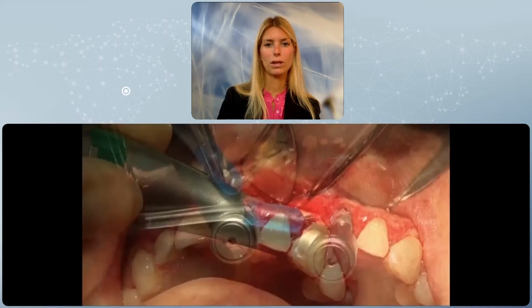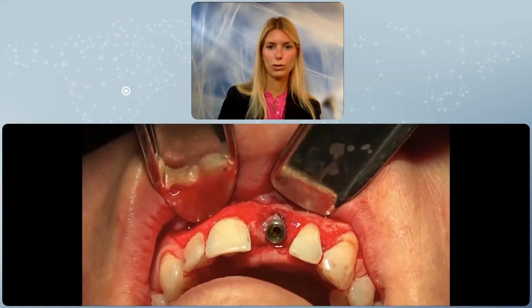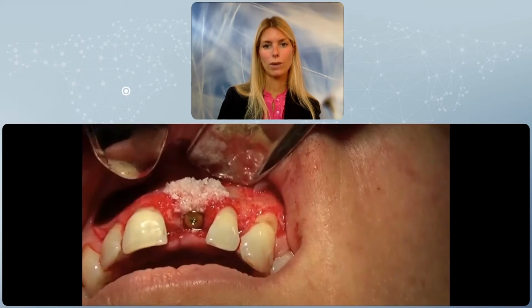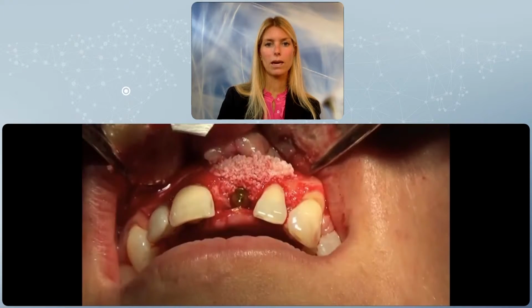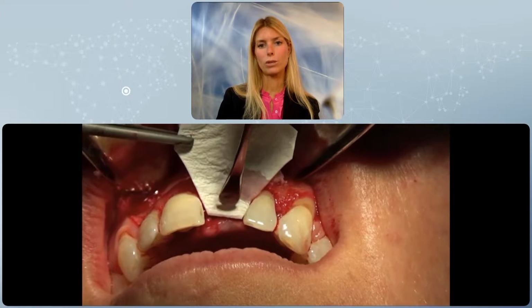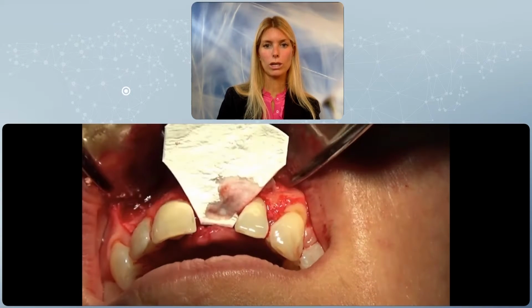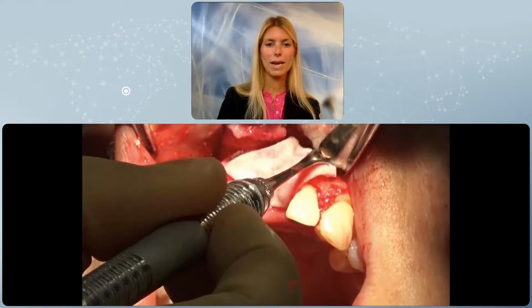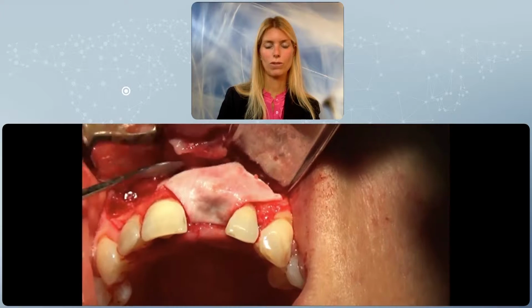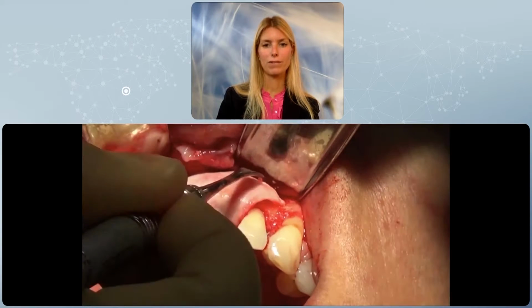As you see, the bone particles are nicely adapted without over-contouring. And the collagen barrier membrane is again shaped in the right position so that it covers all the area, and it can be either pinned or not, but in this case the defect was not large enough to justify pinning of the membrane. And now this is the most crucial portion, which is the releasing incision of the periosteum to allow a completely tension-free and passive flap.